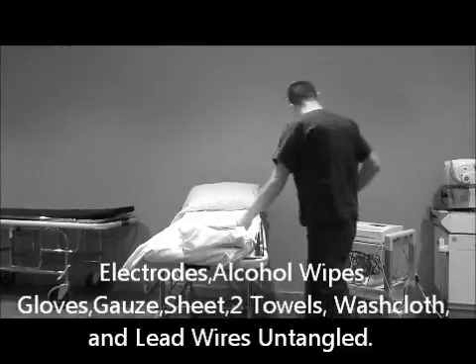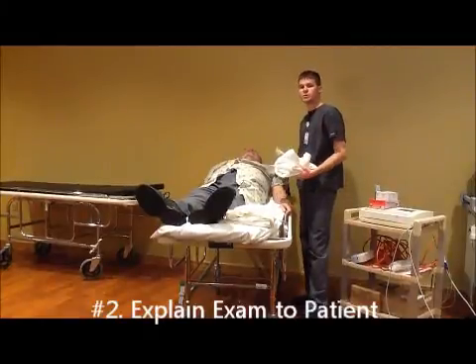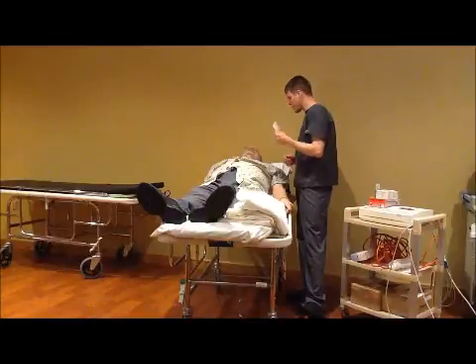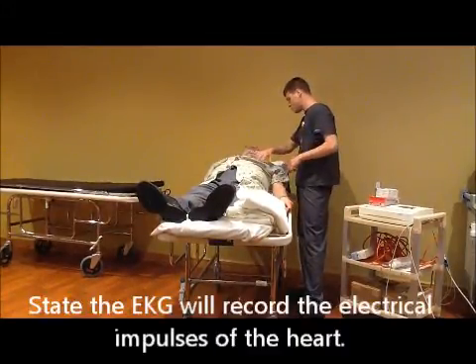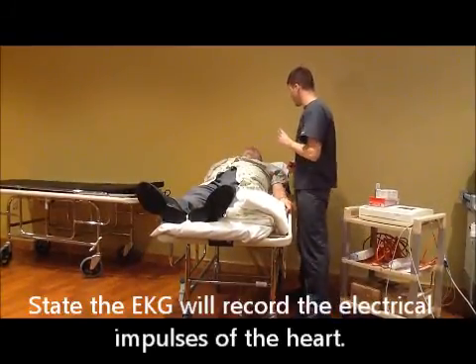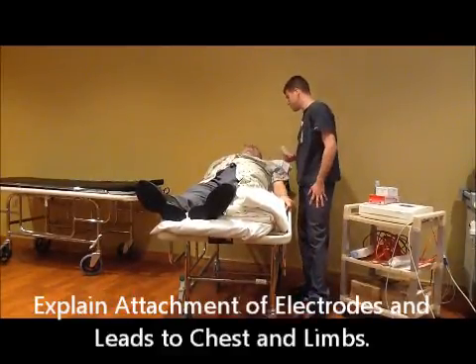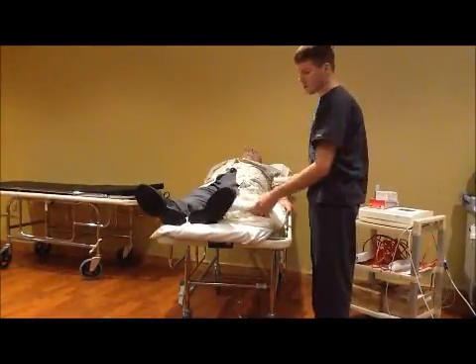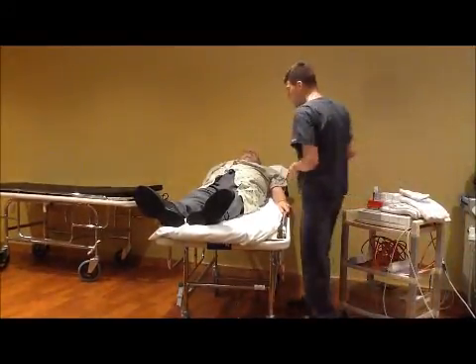Once you're all ready and the patient's all ready, go ahead and explain to them what you're going to be doing. Have you ever had an EKG done before, sir? No. Well, I have some electrodes here that I'm going to be placing on your body in different spots — your right side, your left side, your chest, and then your arms and your legs. We're going to get a reading of the electrical impulse of your heart. Do you have any questions? Once you're done explaining, make sure to ask if they have any questions.